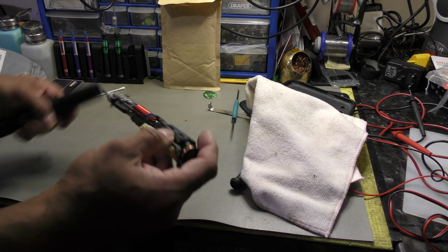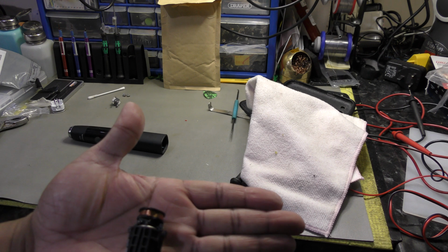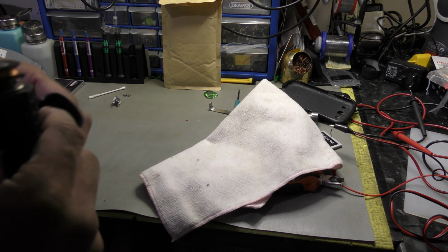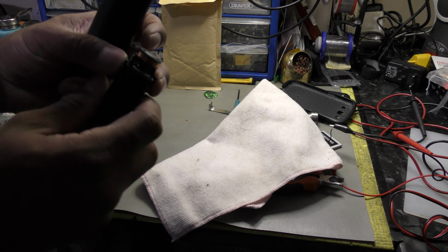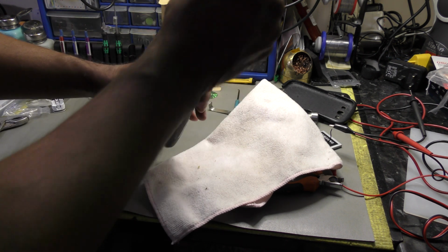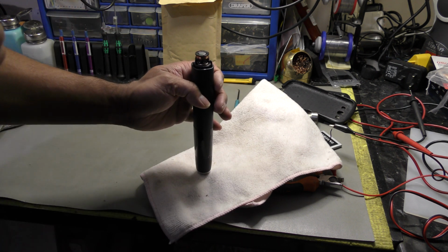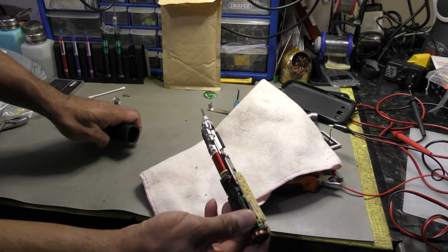Okay, so this is because there's two clips here. I'll show you if you can get a white background and you can just about see here. Okay, see those studs? One there and one there. That is actually clipped into the housing. So all you've got to do is pry those clips in, putting a little bit of force down like this, and then just poke those clips inwards as you're pressing down on this, not with an immense amount of pressure, just slightly, and then the whole thing will just release out like that basically.